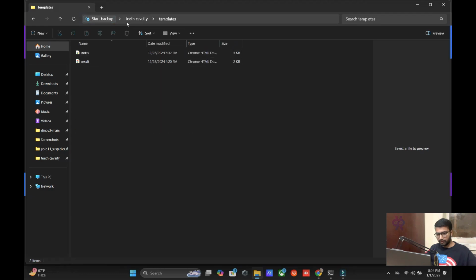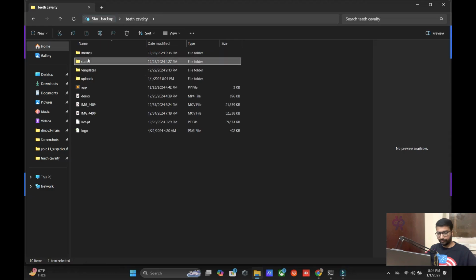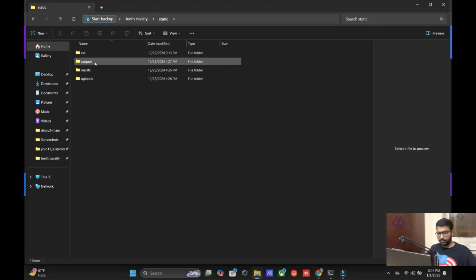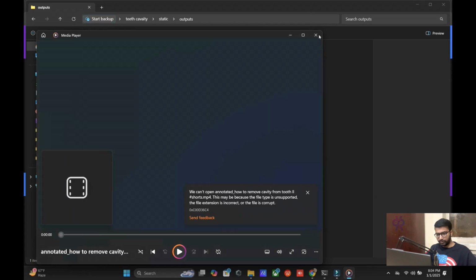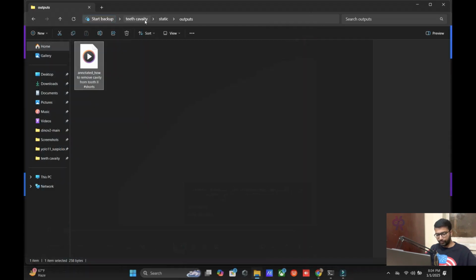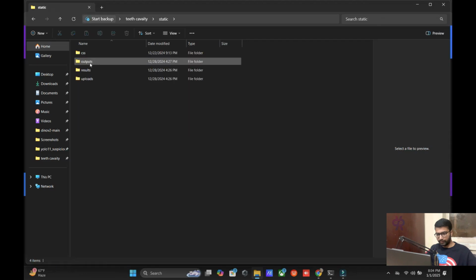Okay, here static file, static file output. Here output means what you want to see. So you can see here output and result. The result is not working. Okay, only output. You put the models here also.